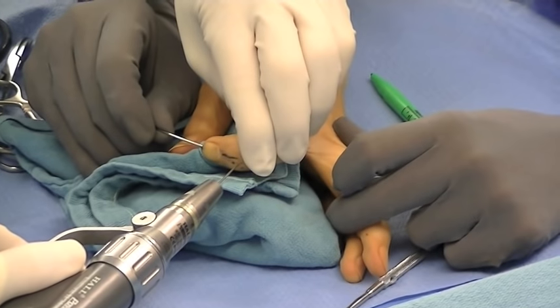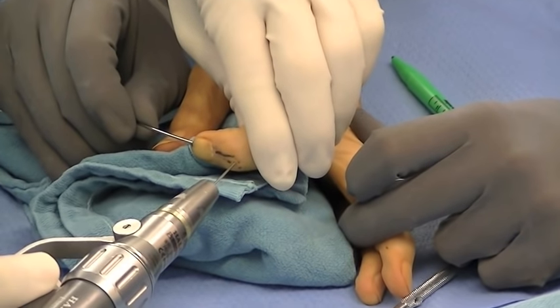With this in place, it's then possible to insert a secondary blocking pin that traps the small bony fragment, as shown here in this radiograph.